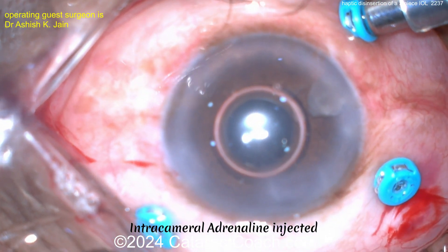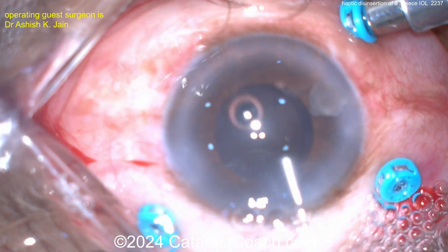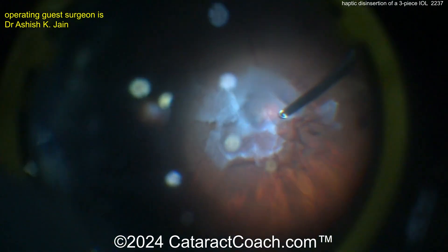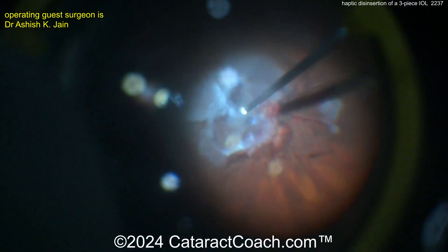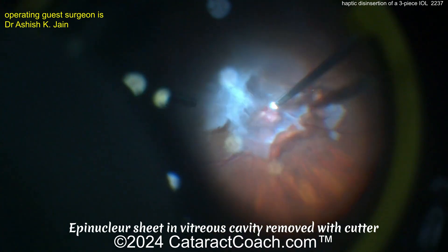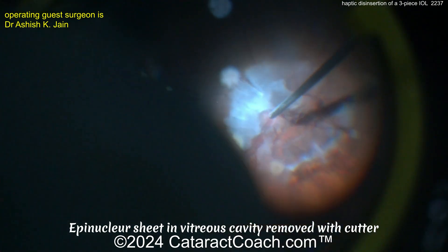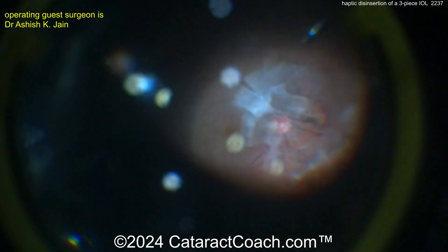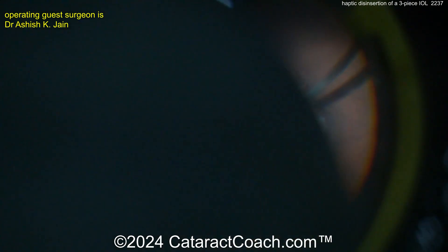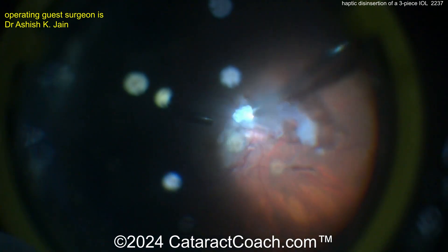It looks like some intracameral adrenaline — epinephrine — is injected to get that pupil expanded. There's a big chunk of nucleus still on the iris there in the angle. More nucleus here, more lens material, maybe cortex, and an epinuclear sheet in the vitreous cavity. Using the vitrectomy cutter to remove that — it looks like an epinuclear shell. If it was a dense piece of nucleus you may not be able to remove it just with the vitreous cutter; you may need the phacofragmatome or another technique.